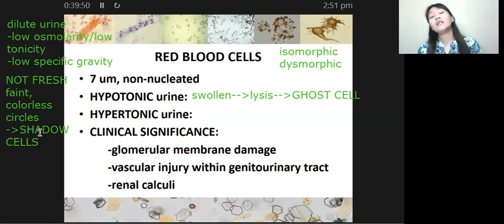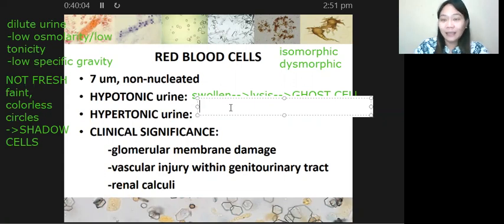Okay, ayan. So, another is, for example, in the laboratory, you received a hypertonic urine. Okay? So pag sinabi naman po natin class na hypertonic ang urine sample, so i-characterize lang natin siya ha, yung sample na yon ay concentrated. Okay, so it is a concentrated urine sample.